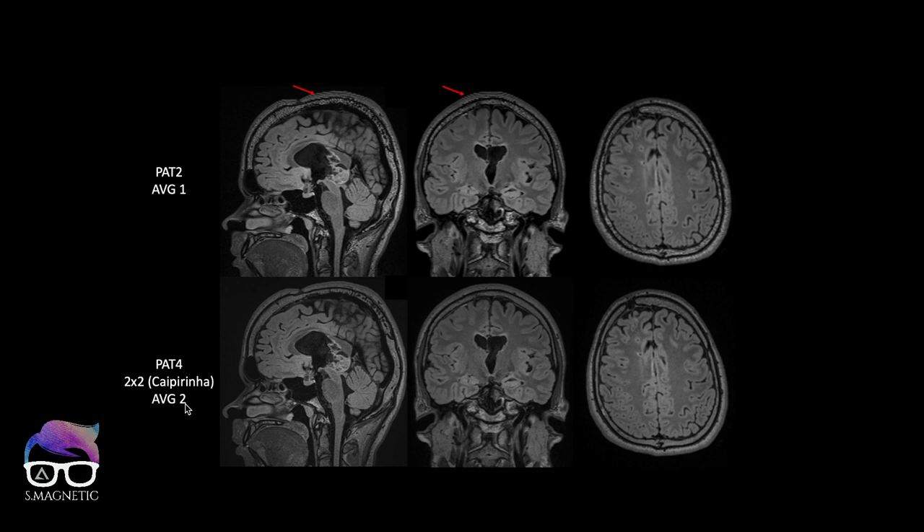The lower row has averages set to 2. So going from 1 to 2, we remove the artifact, but you also get a prolonged scan time. So we combine it with PAT 4, 2x2 CAIPIRINHA. Why are we not using GRAPPA 4? I'm not going into details in this video, but the solution for having the same or better image quality is using CAIPIRINHA with a higher PAT factor, which is done in this case.